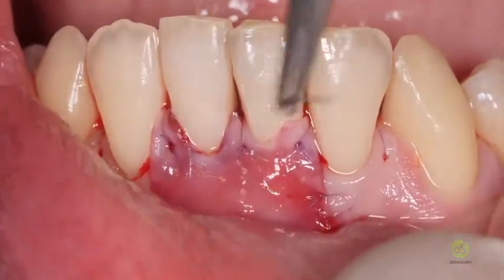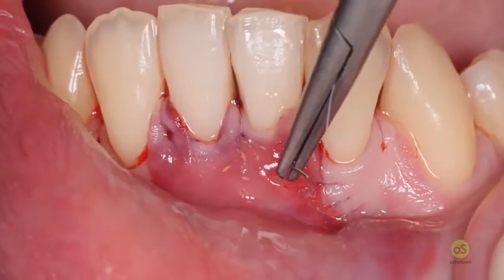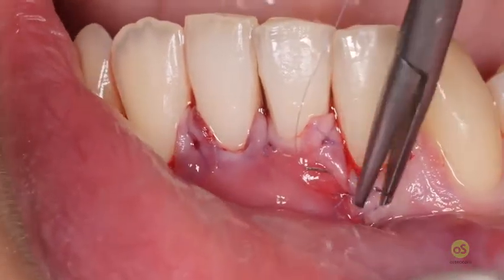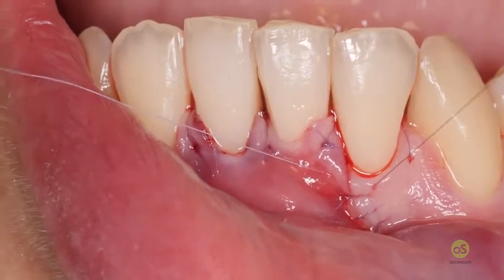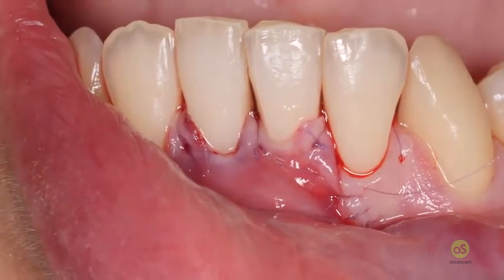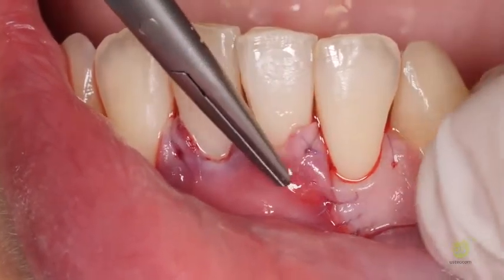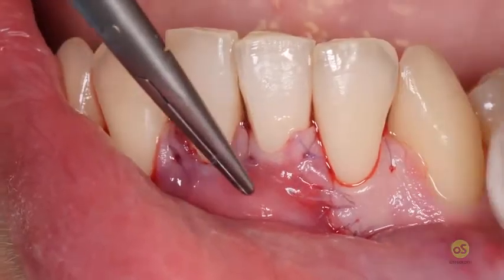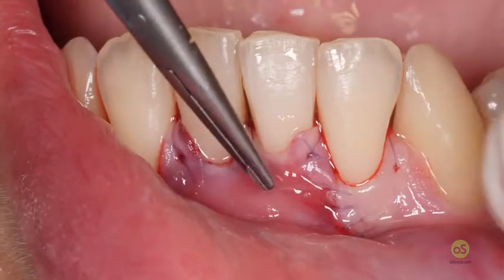you see, when you get closer to the adjacent tooth, you change the inclination, and from the flap to the adjacent soft tissue, respecting the area of the soft tissue margin and the probable area so that this is closed completely under any tension, because the papilla is already in the final position.